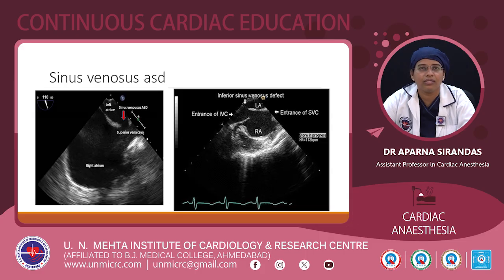So in this you can see superior sinus venosus ASD, that is from the left atrium connecting to the superior vena cava, and this one is the right atrium, and then in the B figure you can see inferior sinus venosus defect, the entrance of the IVC you can see.